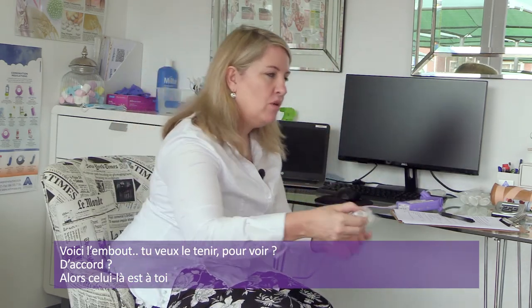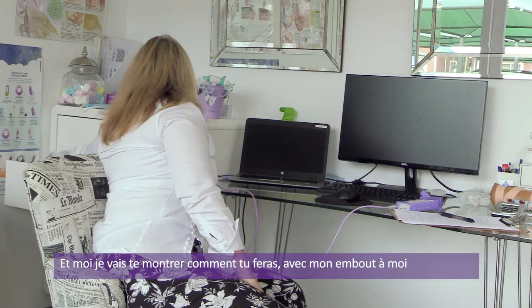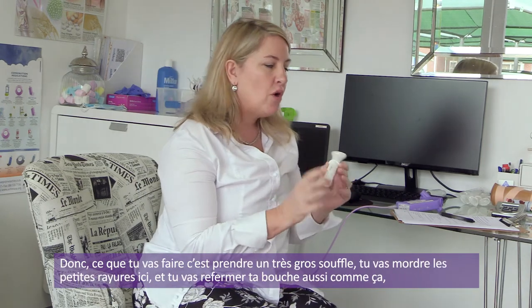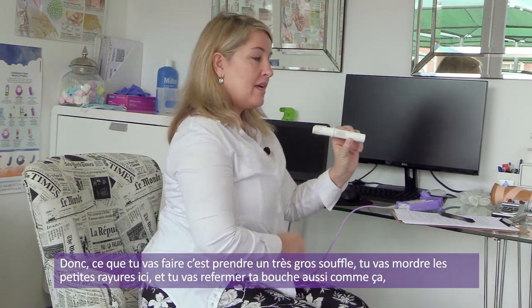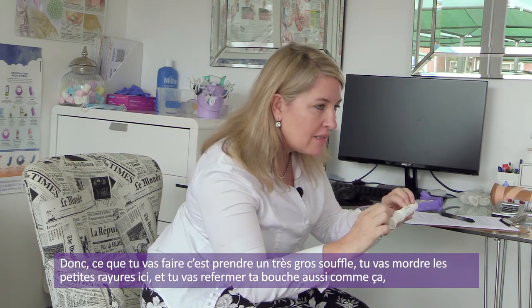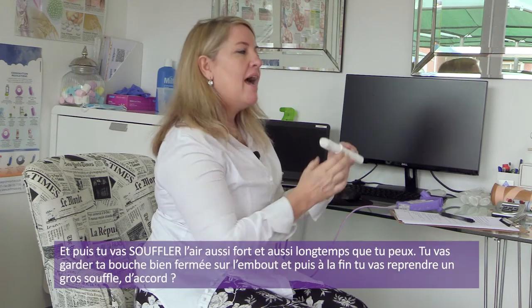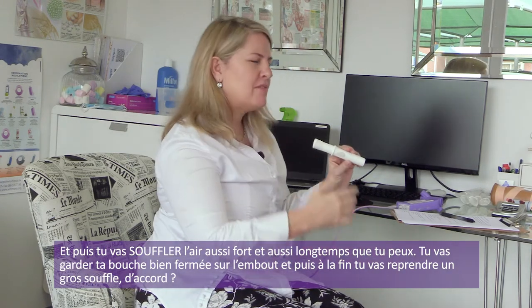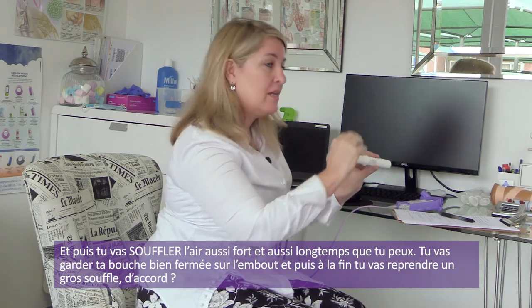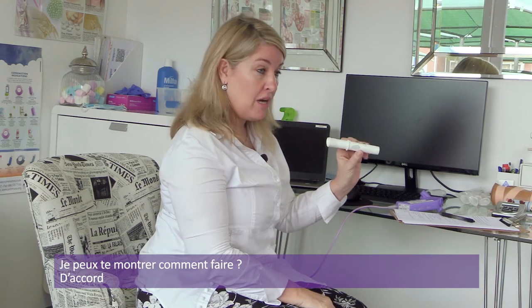Here's the mouthpiece. Do you want to hold it? Do you want to feel it? Okay, so that's going to be your mouthpiece, and let me show you how to do it using my mouthpiece. Okay, so what you're going to do is take a very big breath in, bite your teeth onto these little lines over here, keep your mouth closed across like this, and then blast the air out as fast as you can, for as long as you can. You keep your mouth on the machine, and you breathe in all the way at the end. All right, okay, can I show you how to do it?